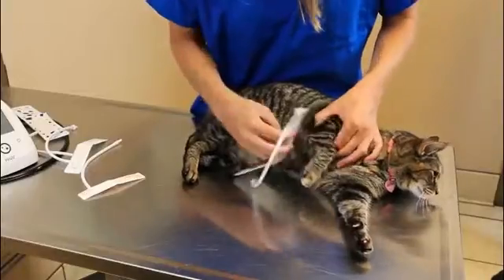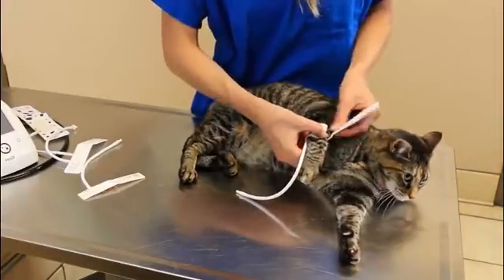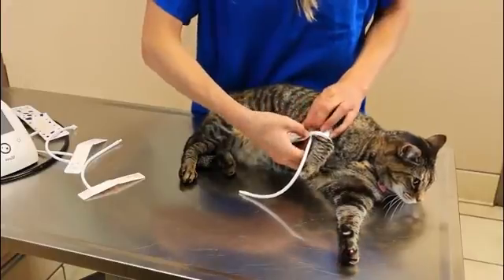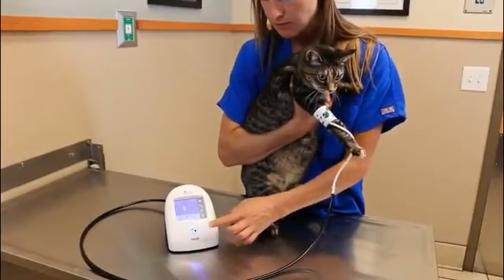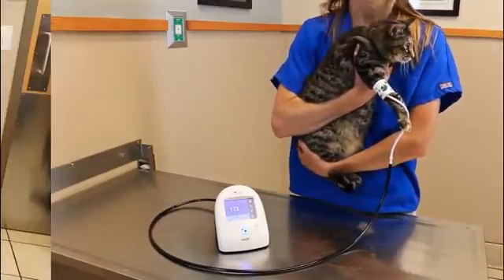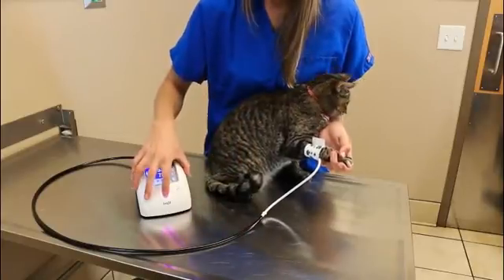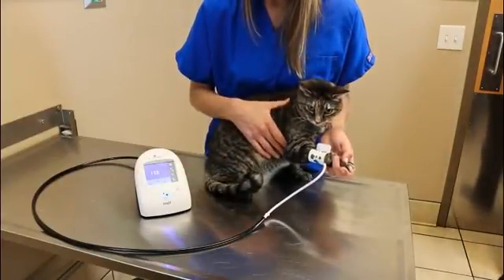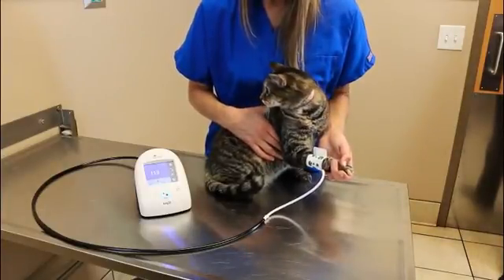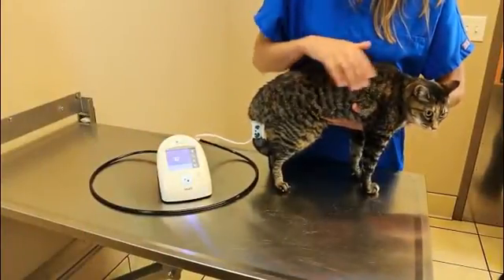The best place to put the cuff on awake companion animals is the front forelimb while the cat or dog is lying on its side, although other positions will also work. The patient can either be lying on the table, the floor, or in the arms of the medical professional or owner. If the patient is seated, the front forelimb is still the preferred cuff location, but the limb should be supported during the BP measurement to keep the forelimb muscles relaxed and to get the cuff to heart level.